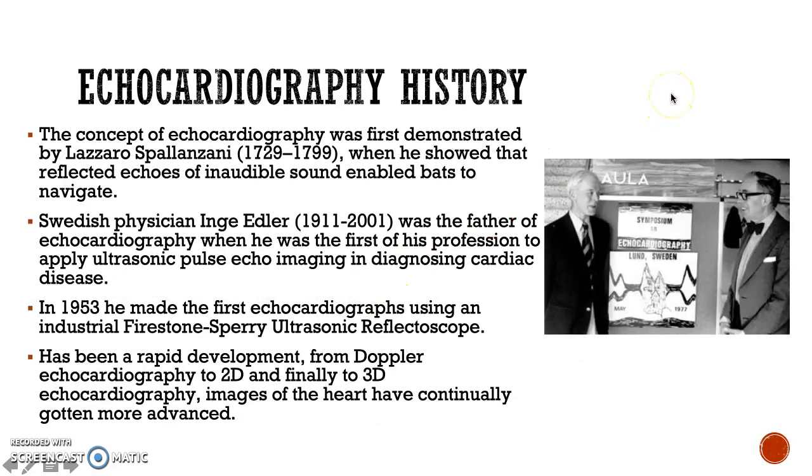Okay, so the history behind echocardiography. The concept of this was first demonstrated by Lazzaro Spallanzani. He showed the reflected echoes of inaudible sound enabling bats to navigate. So he was basically the founder of these echoes and these waves.